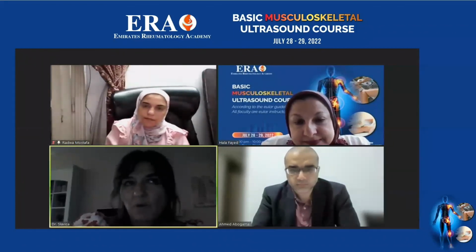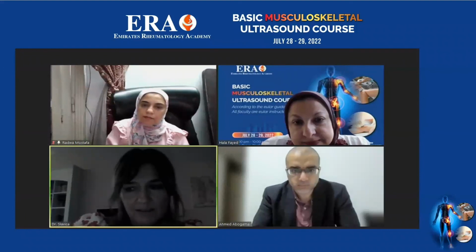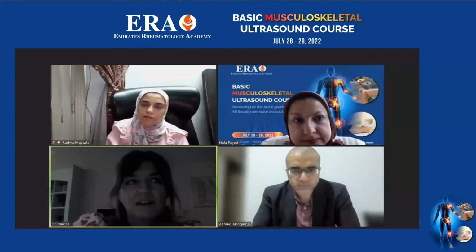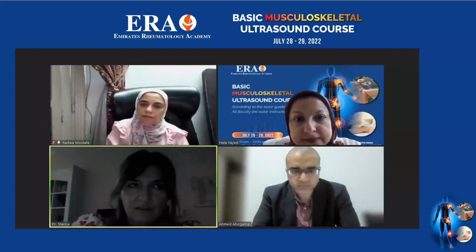From my point of view, I found peritrochanteritis most often as the cause of this pain. Of course, I always need an ultrasound examination to confirm this finding, but in that case, I usually found some pathology at the level of the greater trochanter.